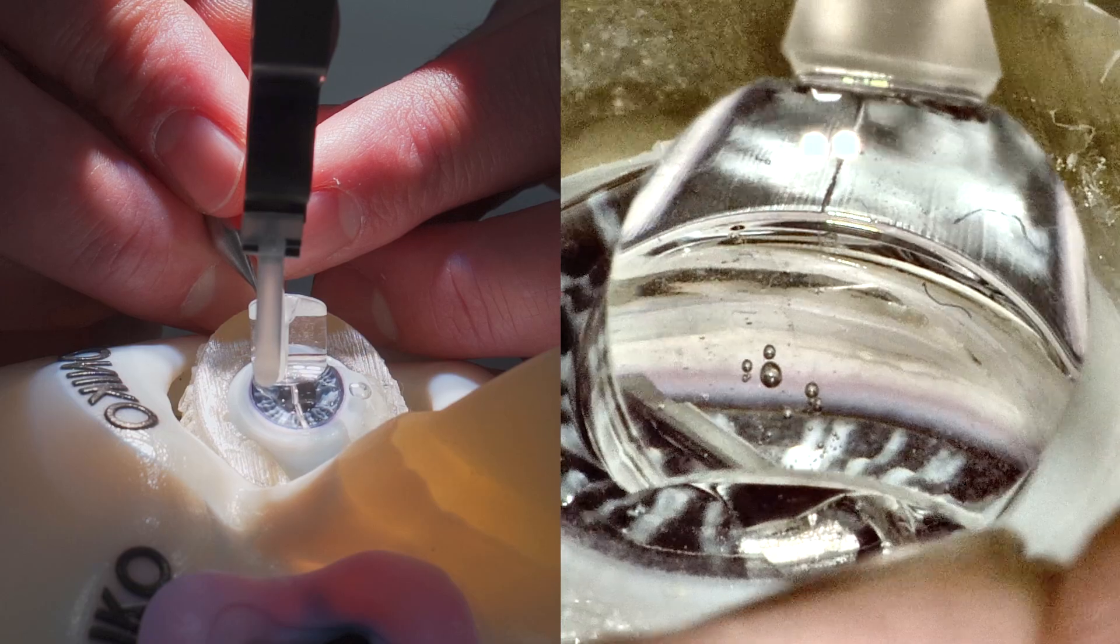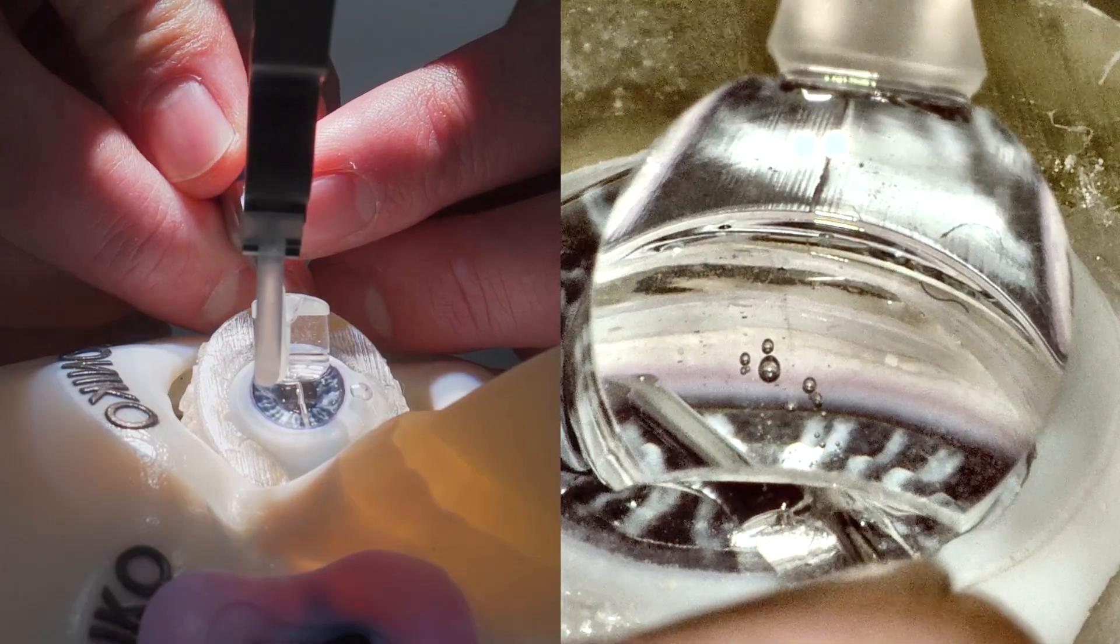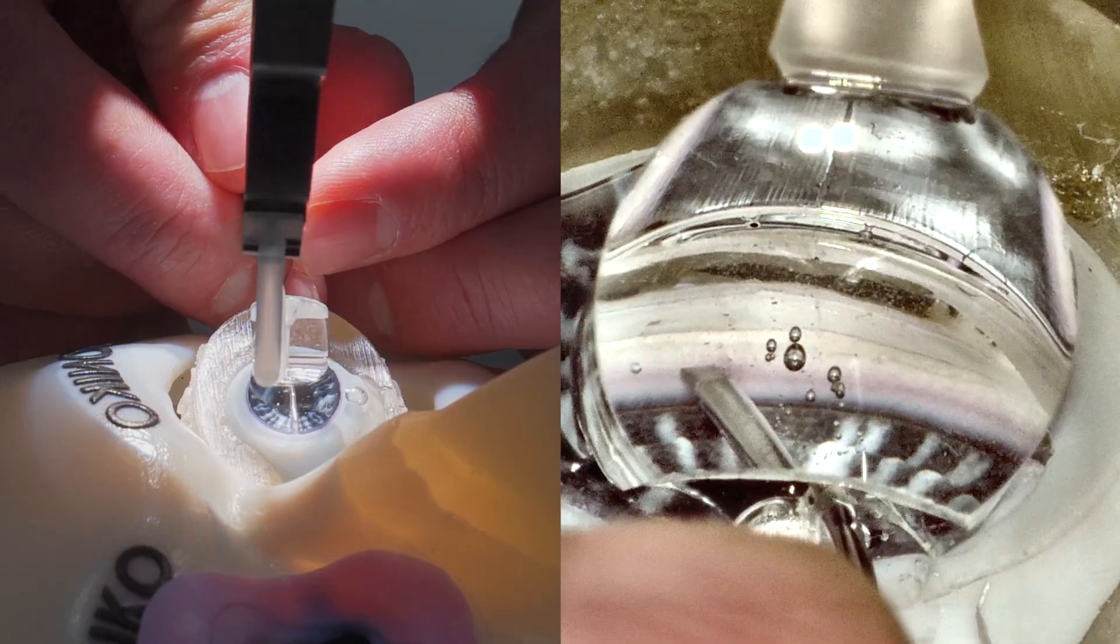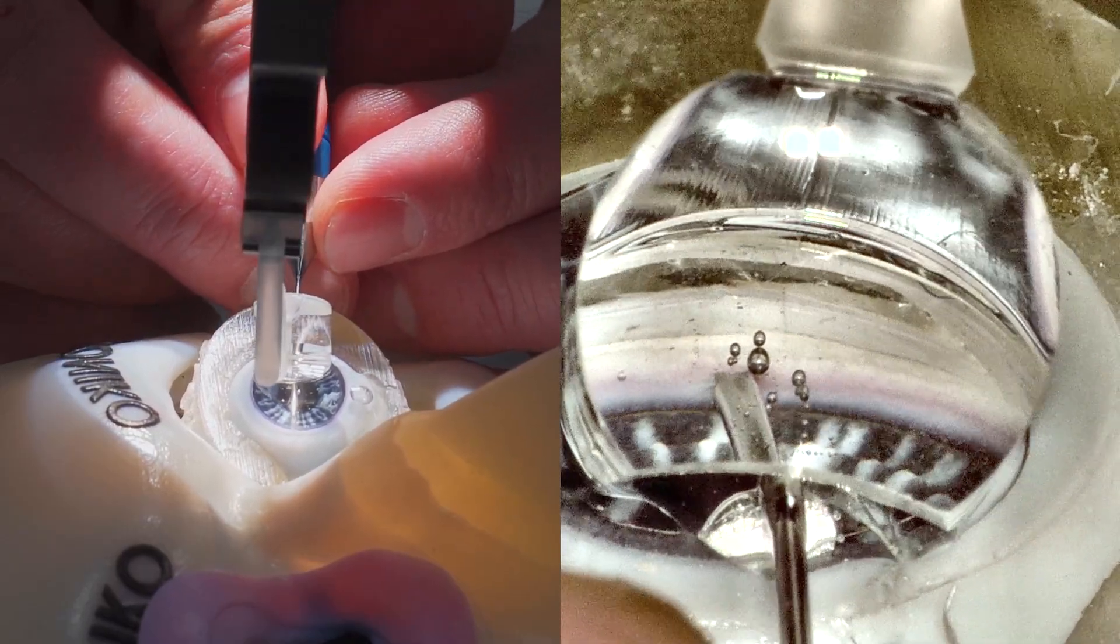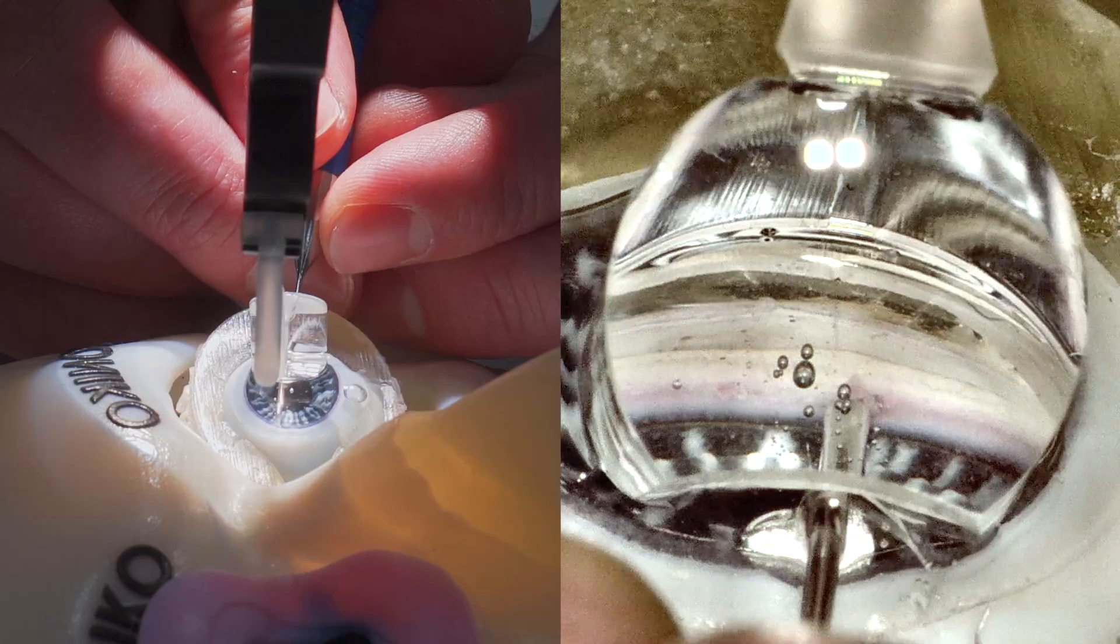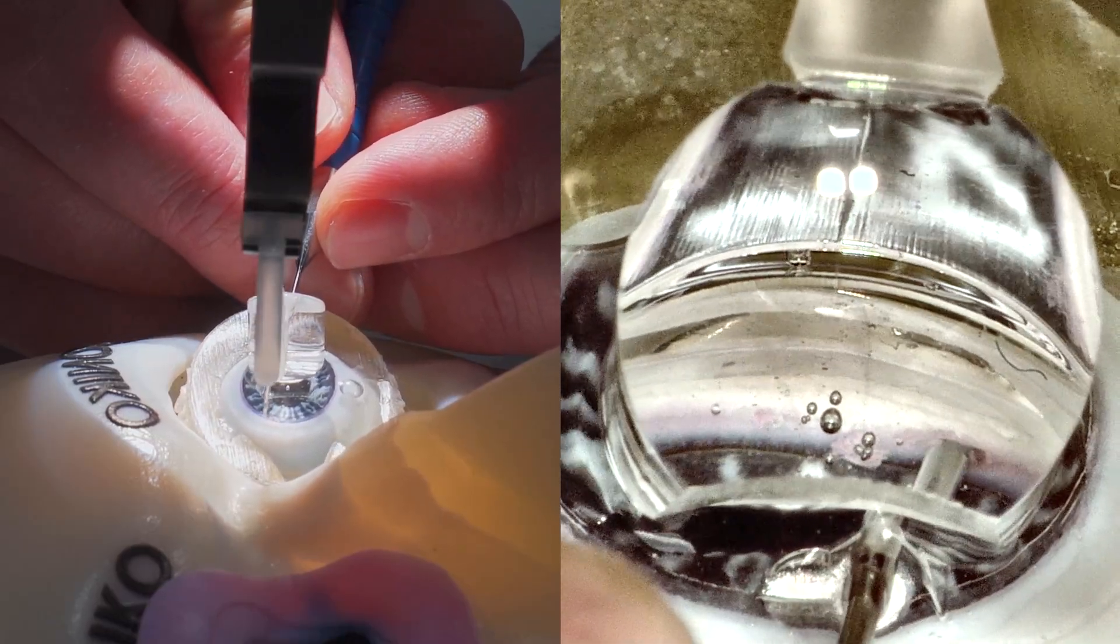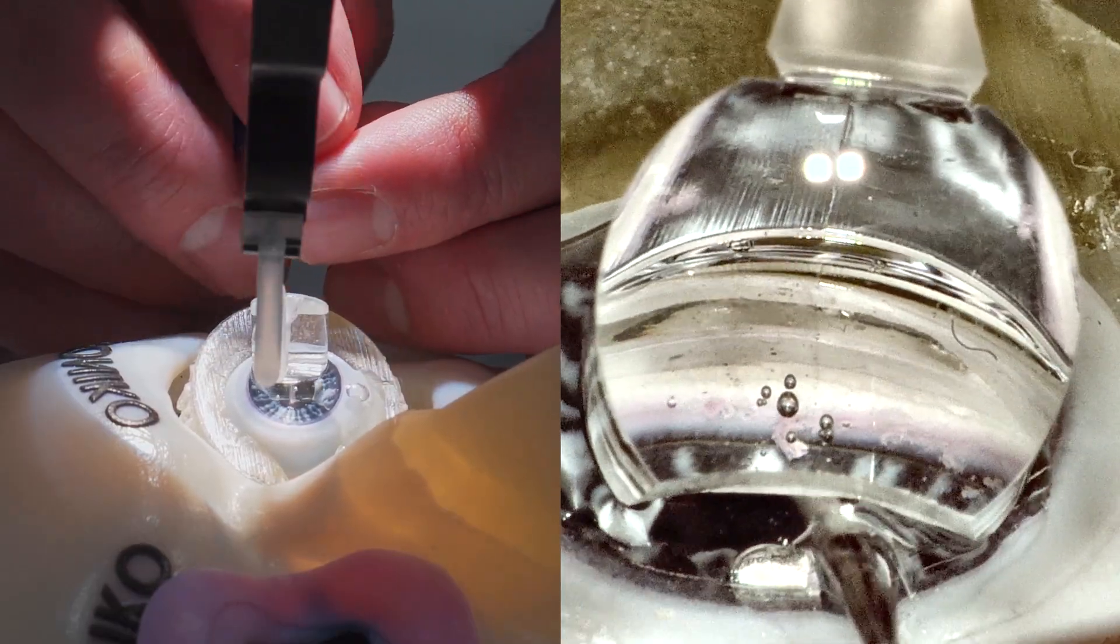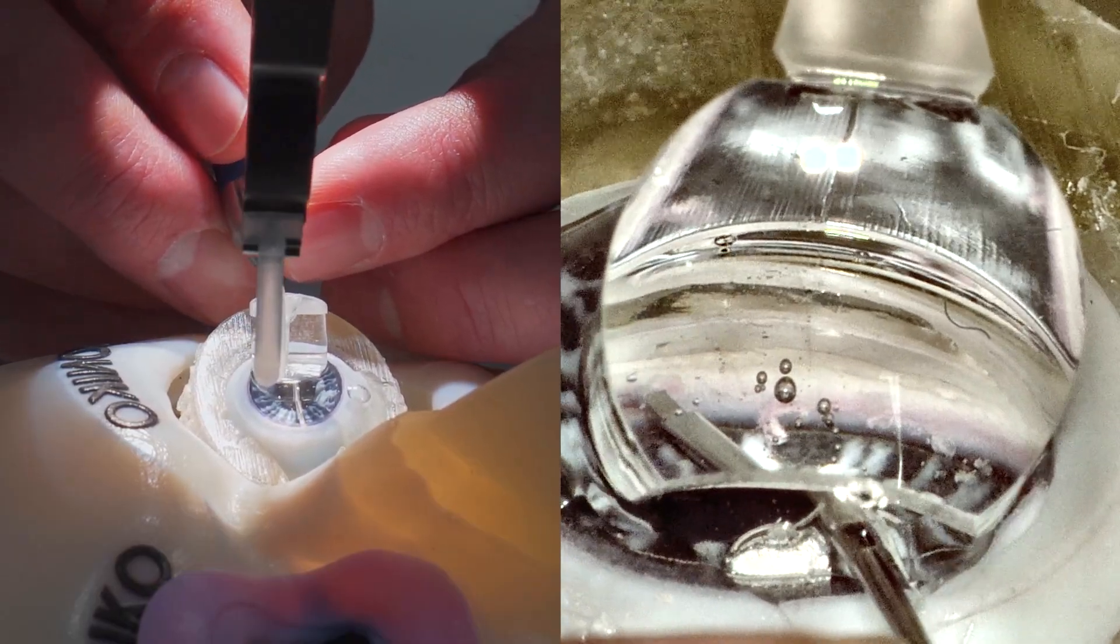Whether you're going forehand or backhand—backhand especially I think is particularly difficult for a lot of surgeons, especially starting out—it's just a much more controlled procedure here when I have two hands on the device. You see how well of a seal it's keeping. Even though I'm moving the eye, I'm going to switch back to a forehand. It's keeping a nice seal of the lens on the gonio.